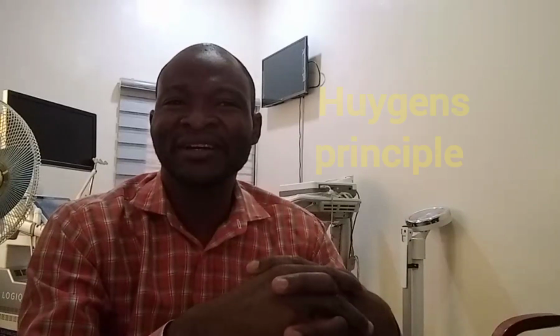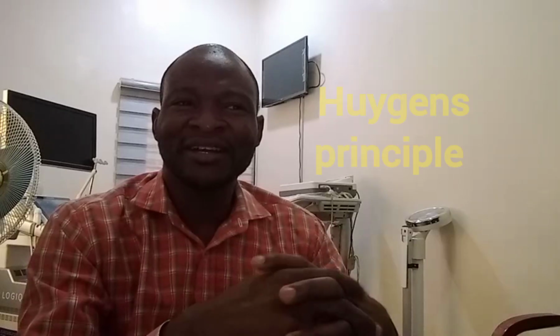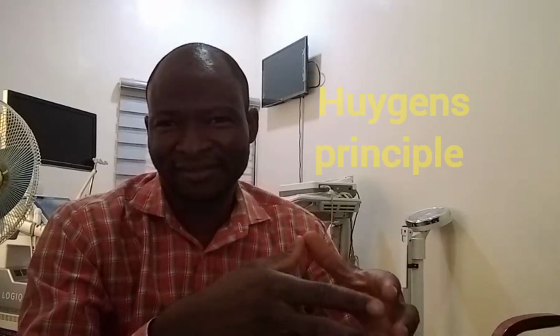The Dutchman, Christian Huygens, postulated that sound waves produced by an imaging transducer do not diffract, but they obey the principle of wave interference, otherwise known as Huygens principle. Now, active elements consist of an indefinite number of sound sources.